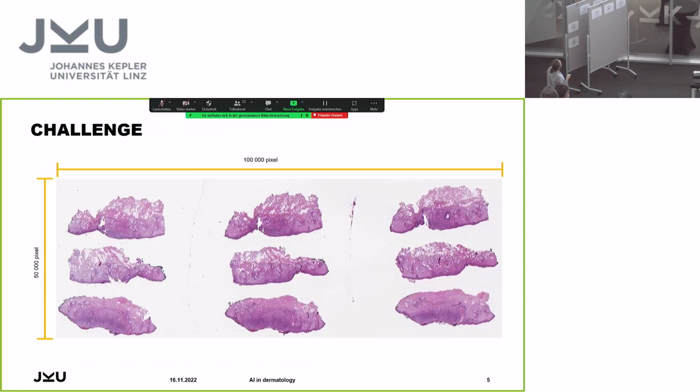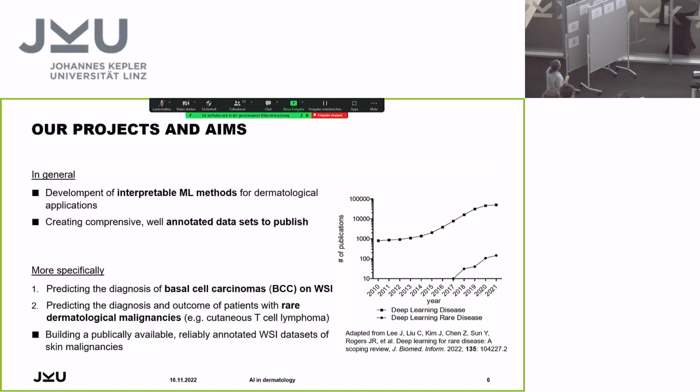That's an example of one of these whole slide images, and as you see, it has really 15 billion data points to process for only one image, so it's really huge. And our projects aim at developing interpretable machine learning methods for dermatology.